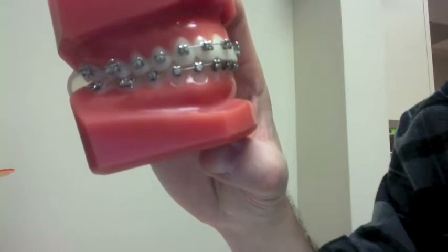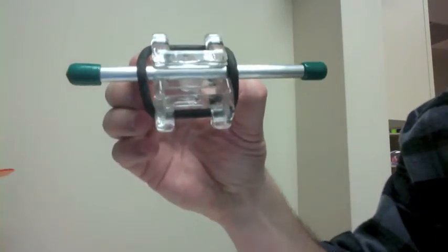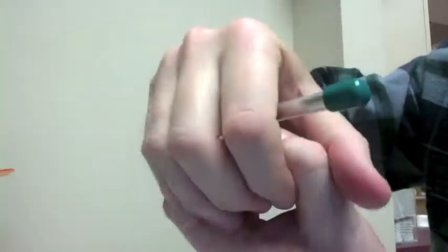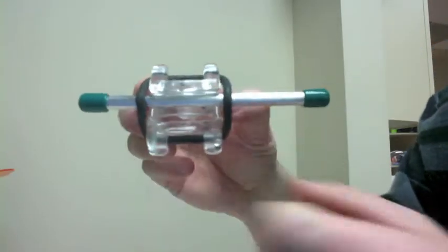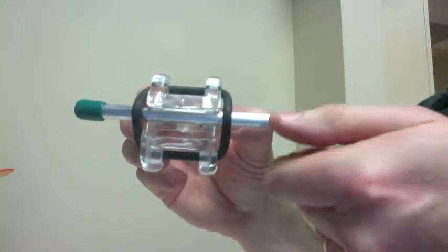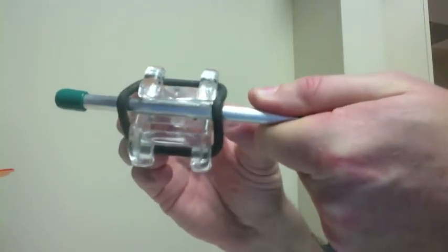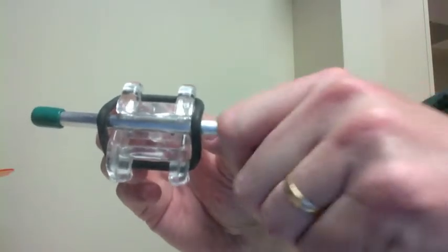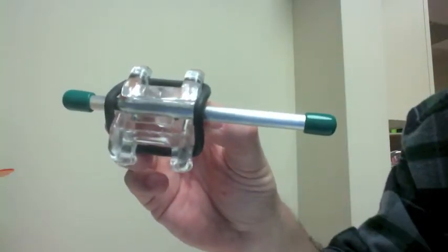Well, why does that make a difference? So you can see it on a larger scale. The old way, with those rubber ties on every bracket, those rubber ties acted like little bungee cords. They grabbed onto that wire and held the wire in very tightly. Well, when we move teeth with braces, we move the teeth by sliding them along the arch wire. And with the rubber ties in place, they didn't slide so well. There was a lot of binding and friction on every bracket. So in order to get teeth to move, we had to overcome that binding and friction, which meant we had to pull with a lot of force. So the old way was a very high force method of moving teeth.